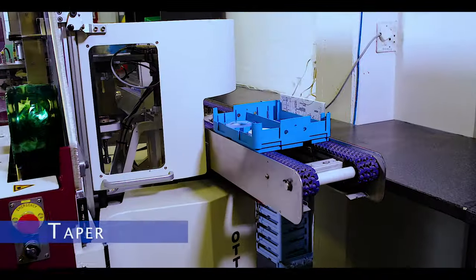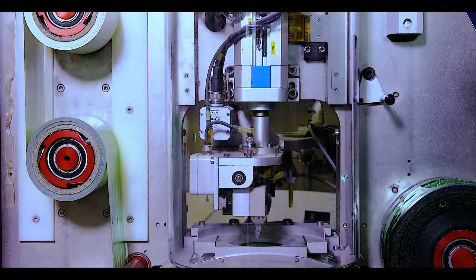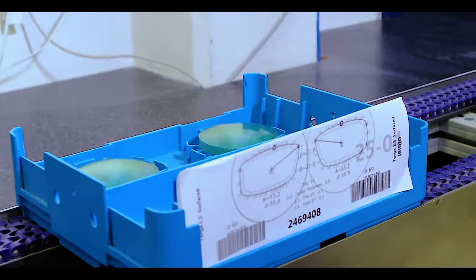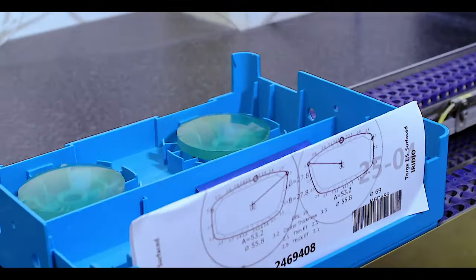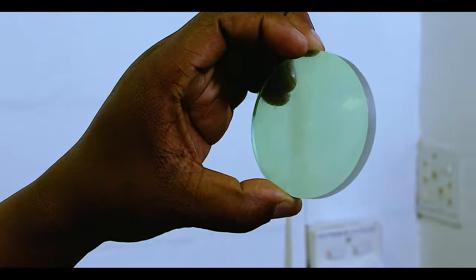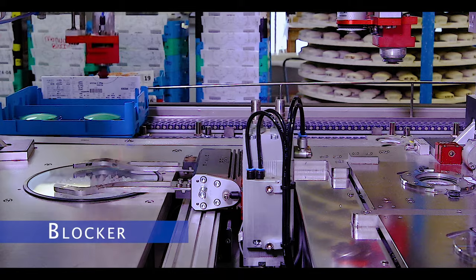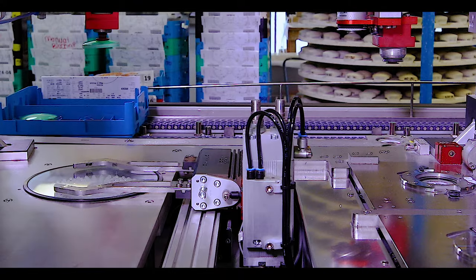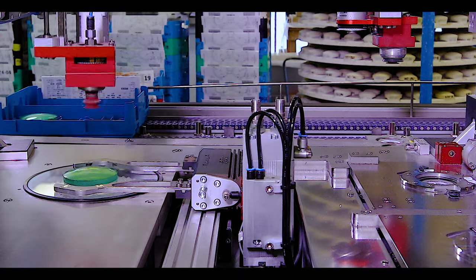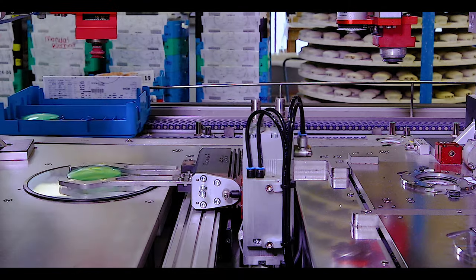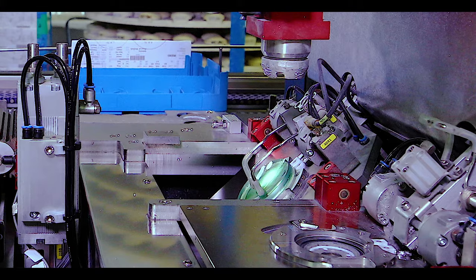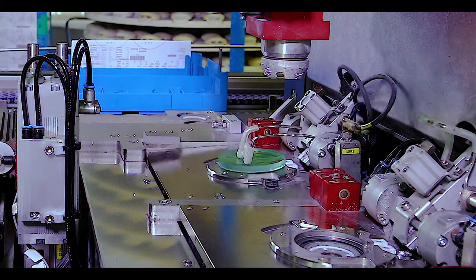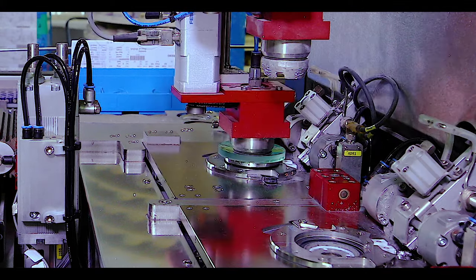Special tape is applied to the front of the lens material to keep it from being damaged during processing. A blocker is used to find and layout the lens as well as apply the block to the lens and makes it possible for the lens to be mounted into the lens generator for processing.